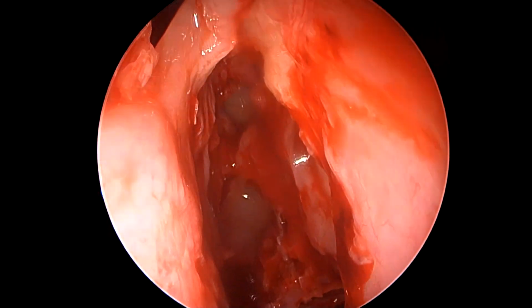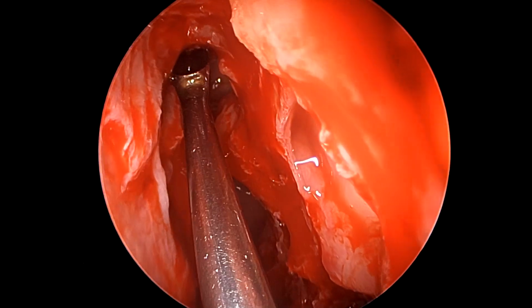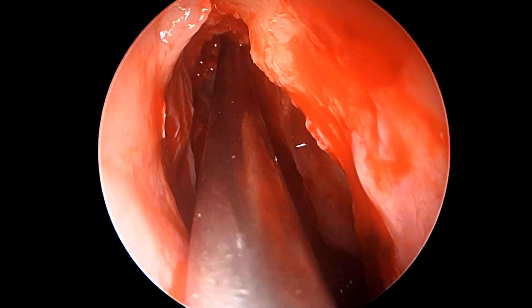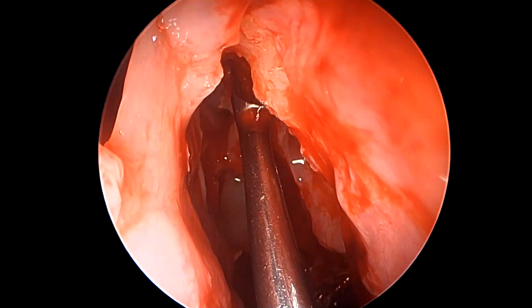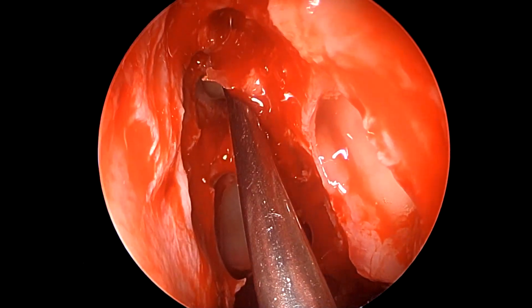That is why creating clear distinctions between the Kuhn cells, which are anteriorly based, and the suprabullar cells, which are posteriorly based along the frontal sinus posterior wall and skull base, is so very important to avoid complications in frontal sinus surgery. So here we're taking our probe, the frontal sinus seeker, anterior to the suprabullar cell that we have already identified, and you can see here, we seem to have entered the frontal sinus proper.